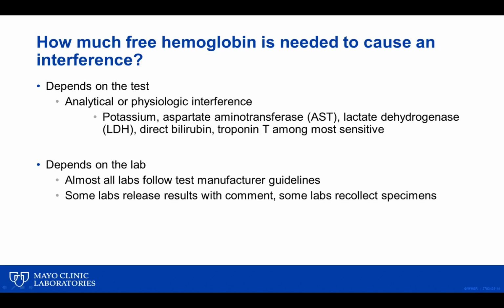And then the next depends on the lab. So most labs will follow test manufacturer guidelines. Manufacturers in their instructions provide a cutoff for how much hemolysis is acceptable, above which the results may be compromised. However, some labs will release results with a comment. Some labs will recollect specimens. There are other labs, and we have labs at Mayo, where we often do some experiments to define our own hemolysis interference thresholds. And so we've validated these and used these. And often we do this to try to raise the threshold that shows that it's not going to impact patient results.